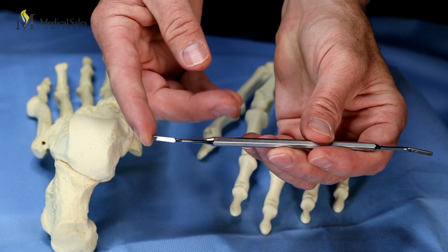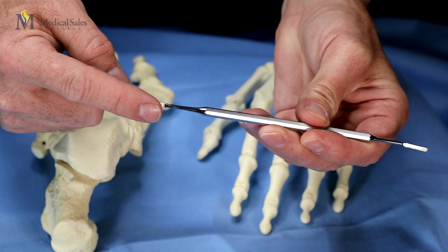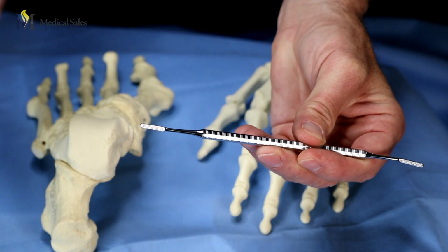A rasp is an instrument that will help smooth down rough bony edges as to not damage the underlying soft tissue or blood vessels. And the difference between a rasp and a file is a rasp cuts in one direction, whereas a file cuts in both directions. These rasps are also important in the operating room to smooth down surfaces of rough bony edges.